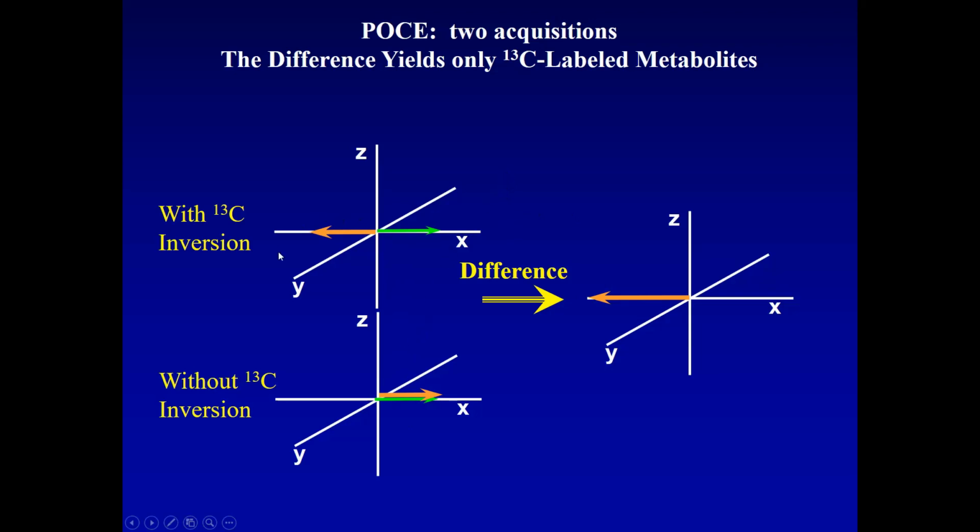And for the carbon-13, we end up with twice the magnetization of the one vector, double the carbon-13 signal. So that's not an enhancement of signal in the protons. We have two acquisitions and we have twice the signal because there are two acquisitions. But the advantage was that we eliminated the carbon-12.